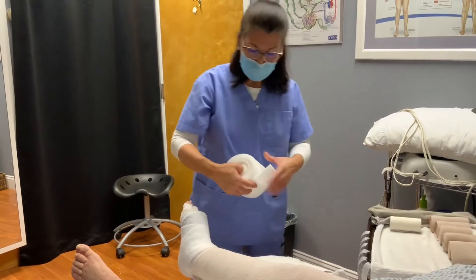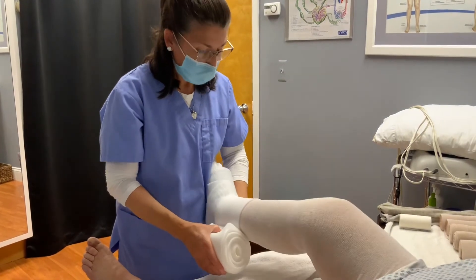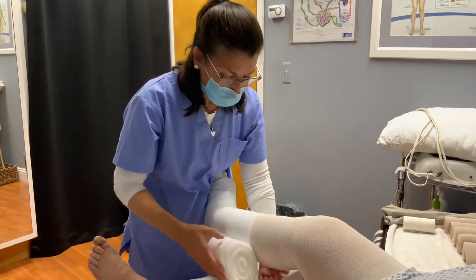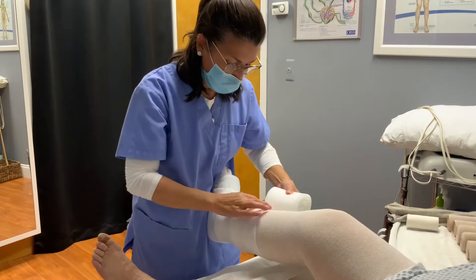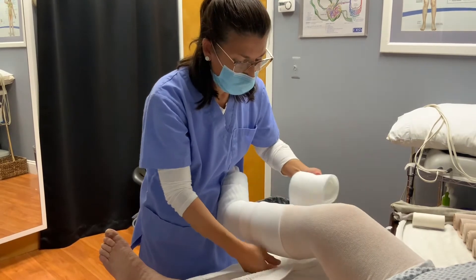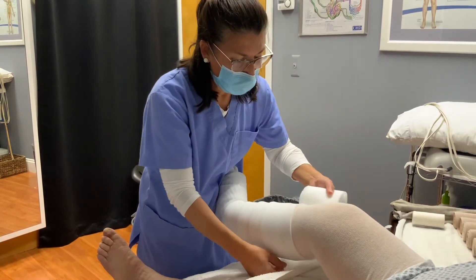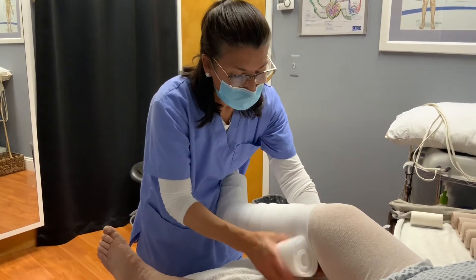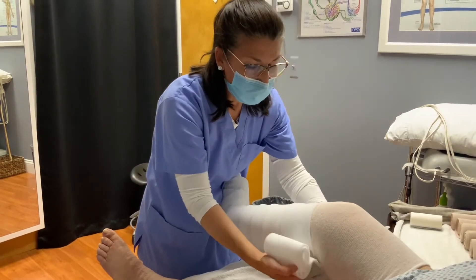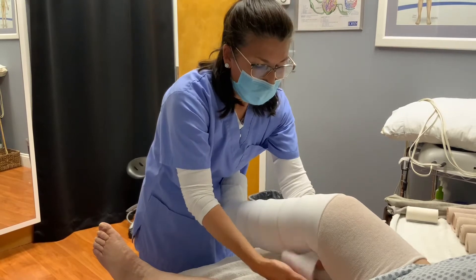After that, we're going to use a white foam. We're just going to lay it on and cover about half of the layer of the foam at a time. We're going to come all the way up to the knee, and in the back of the knee, because we need to give it a little bit of recess, we can double it up in the back, come around and end there.